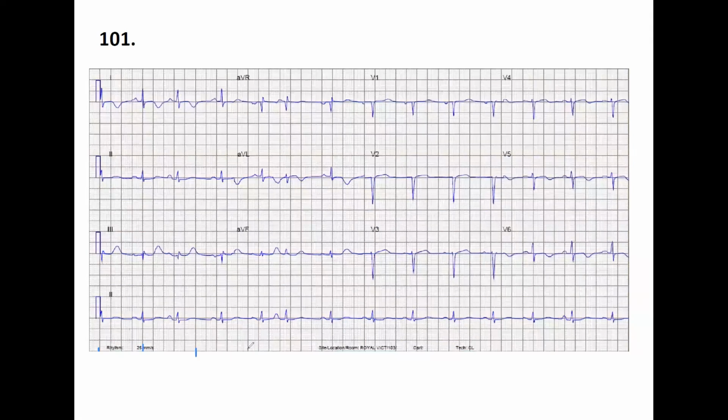The rule of 10, I believe. Or you can go, for example, 6 seconds or so.